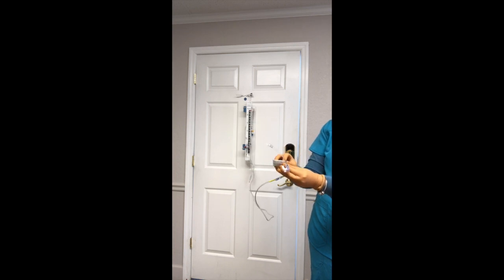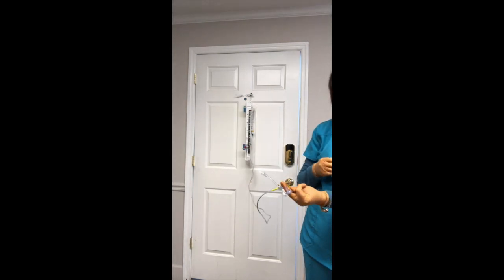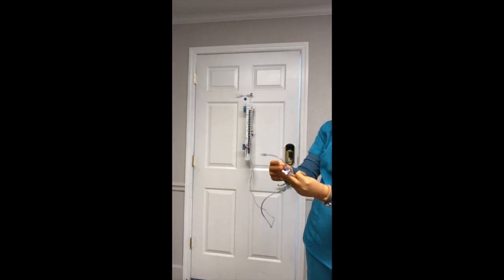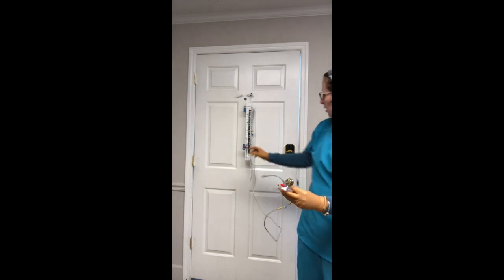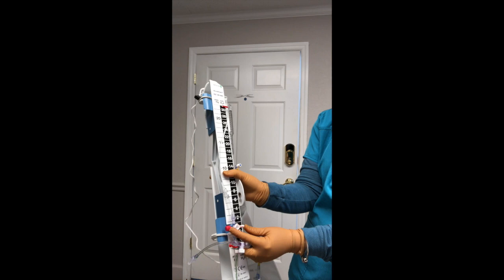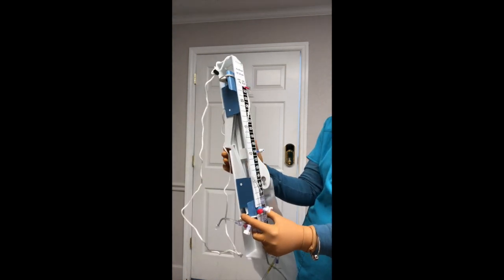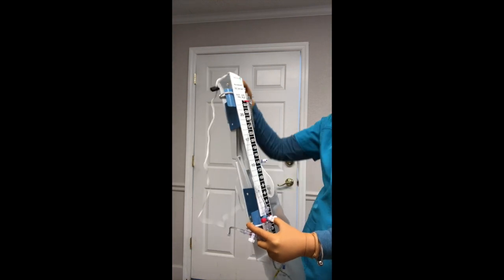If the system needs an A-line, the transducer can be removed. If a transducer is needed, it can be removed from the A-line system and applied directly to the EVD system. This point would be right here. The transducer would need to be primed prior to connecting to the EVD point.